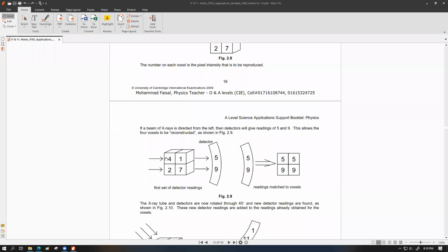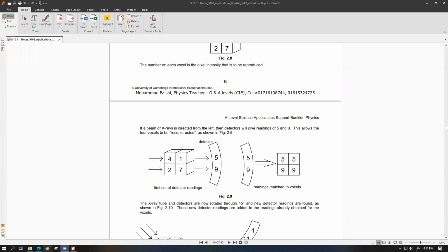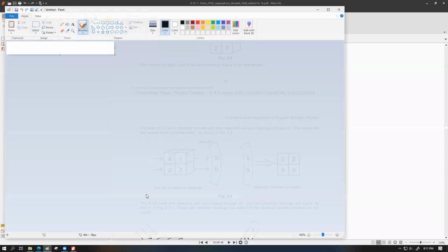Depending upon the capability of the X-ray detector, we would know how many voxels we have within a human body. For example, this view that you are seeing over here might as well be an insanely magnified view of an actual scan. What do I mean by this?